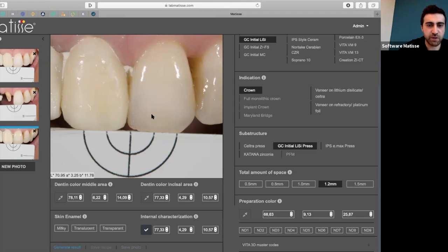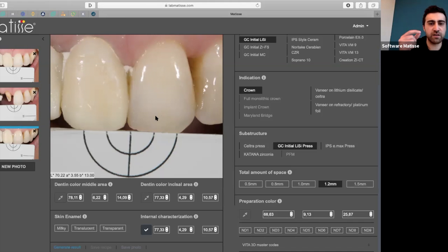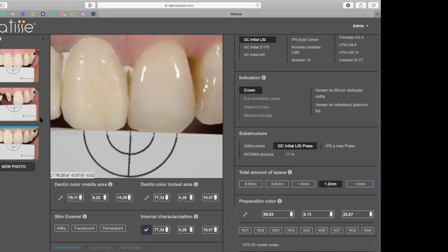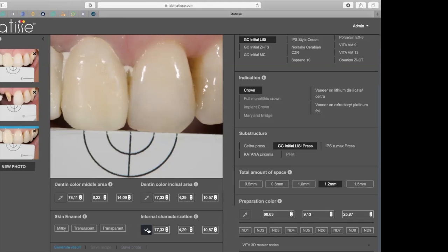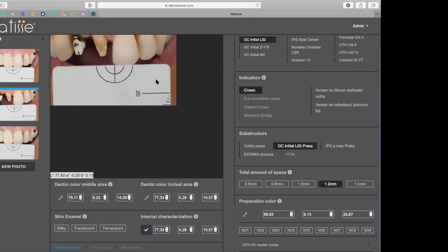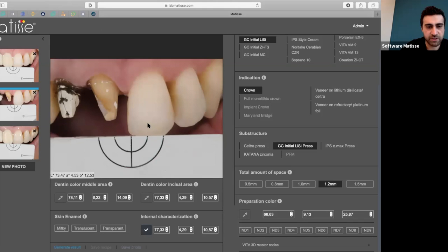Because the thing is, if you use this recipe and apply it there, you will lose a lot of luminosity. Because when you apply the dentin inside, the mix here, you will apply it thin because it's translucent. And when it's translucent, it becomes lower in value, lower luminosity. So I will measure on the transition area.